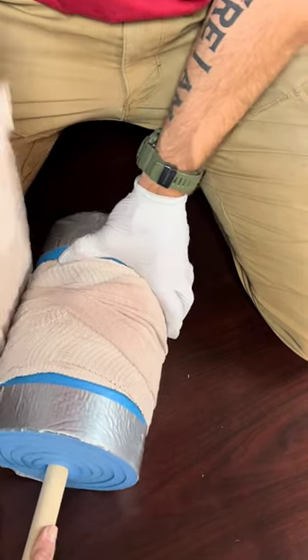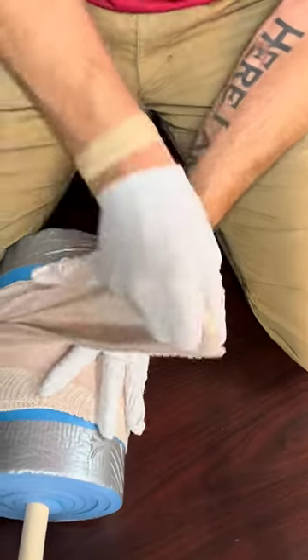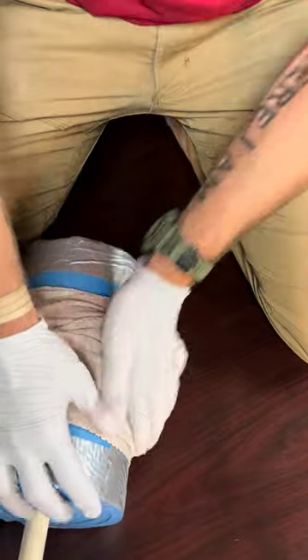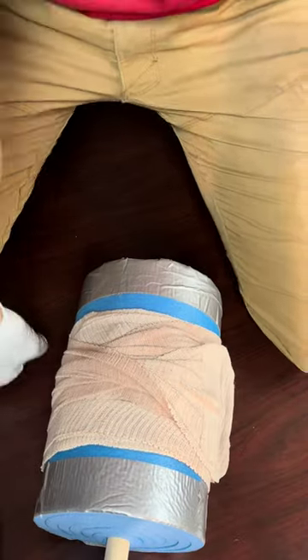Then continue and twist it on the next wrap if possible, and secure with either Velcro or the clips at the end. To get training, go to save1more.life.